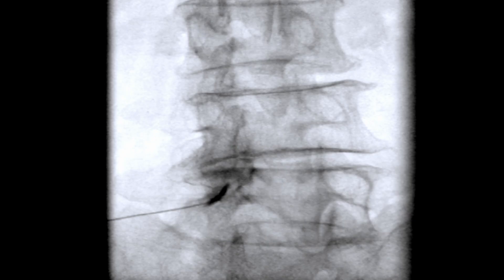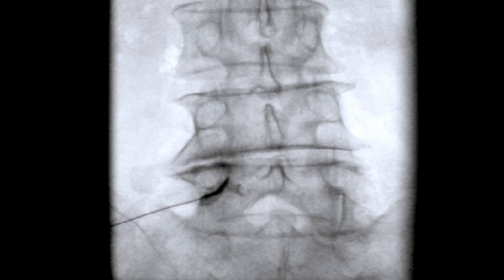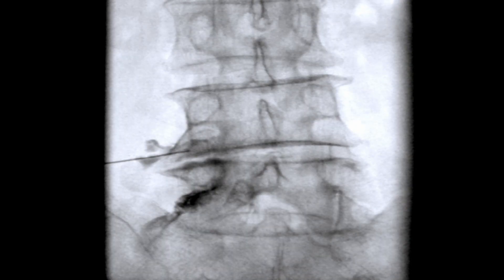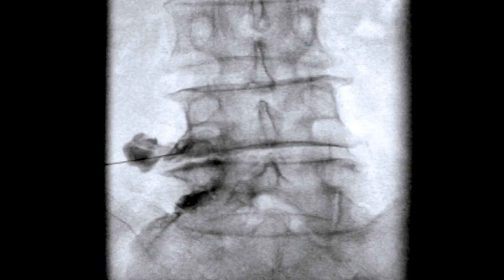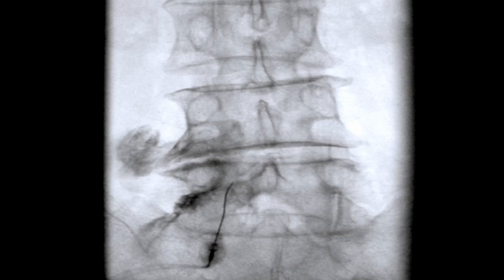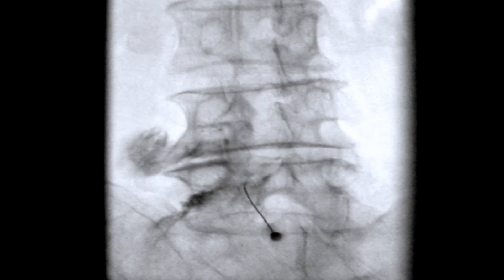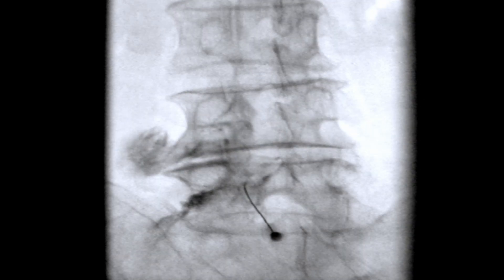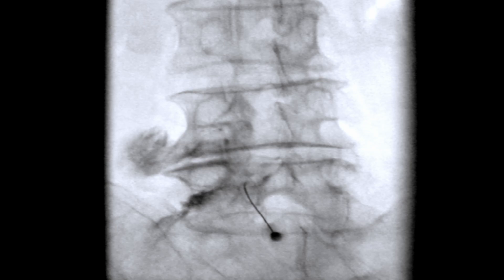Furthermore, I utilize a combination approach for subpedicular stenosis, such as L4-5 subpedicular stenosis caused by disc protrusion — either soft disc or black disc protrusion. In this case, I start with the L5 subpedicular approach and the L4 infranural approach, and combine these with a facet injection at L4-5, which I refer to as a flavo injection. These three targeted areas form a comprehensive treatment strategy for addressing intractable radicular complaints arising from L4-5 subpedicular stenosis.